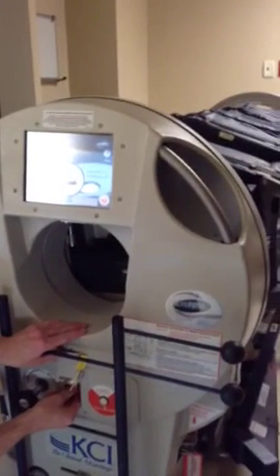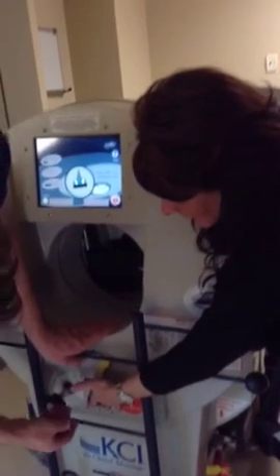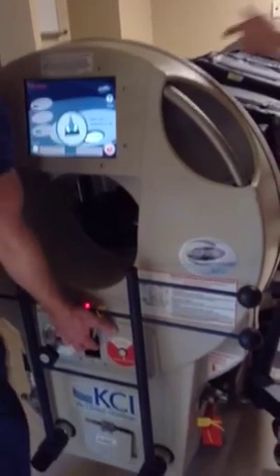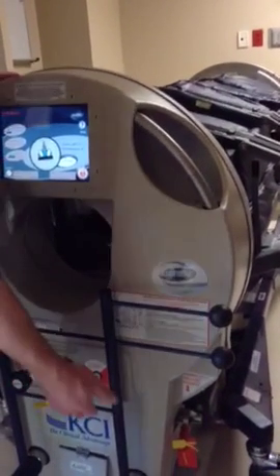Okay, so you pull this up. And then this lever, you pull it up. And then you disengage right here. Pull that, disengage it, release it. Pull your lock pin out, lift this up, and then turn the patient, okay? All right, once you get the patient turned over, check tubing, check airway, check head support, but first you have to re-engage it, okay?